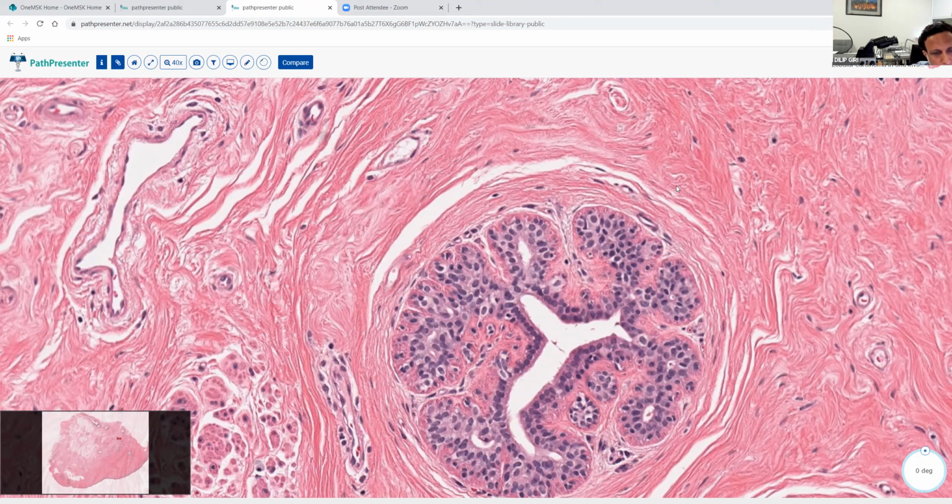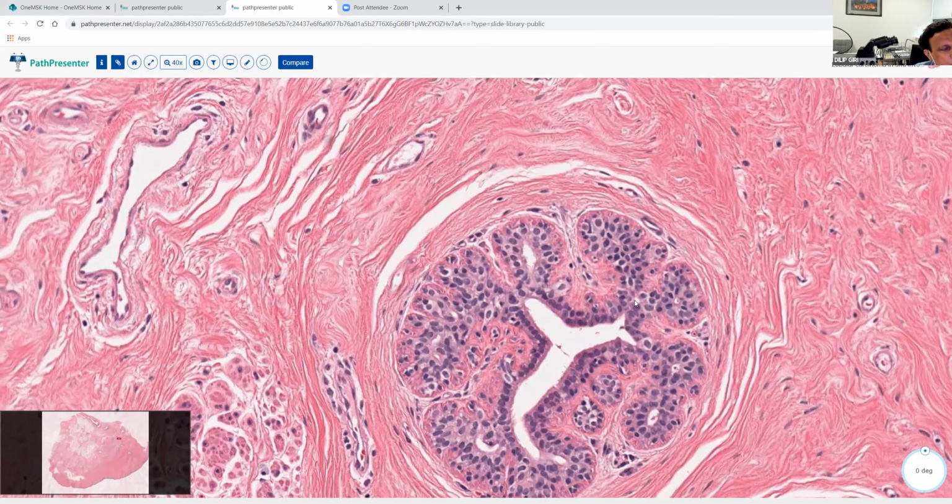Now, it's another matter if also the ductal cells within a unit of in situ carcinoma are also malignant. In that case, there could be grounds to make the interpretation that, yeah, this is mixed DCIS, LCIS. So, I mean, this concept is pretty simple and straightforward, but in some unusual circumstances, you have to keep that in mind, because otherwise you might make wrong interpretations.